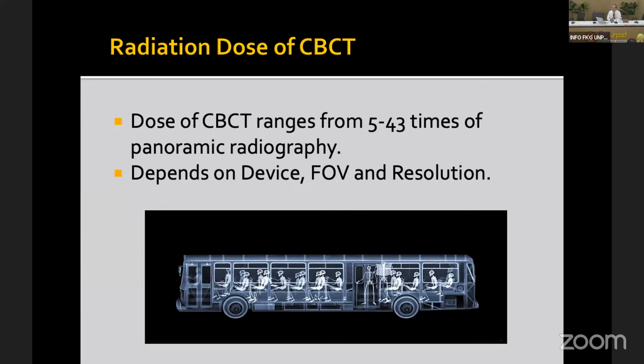So that's why, for the implant study, some patients said that because the medical insurance covers the medical CT, they just want to get the insurance for the implant study. But I have to say that the radiation dose is much higher than cone beam CT. Probably you should choose the cone beam CT instead of the medical CT.